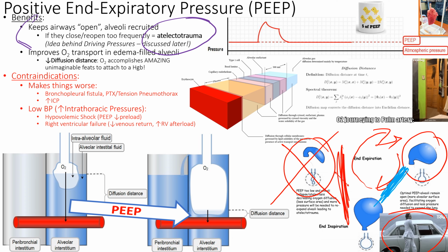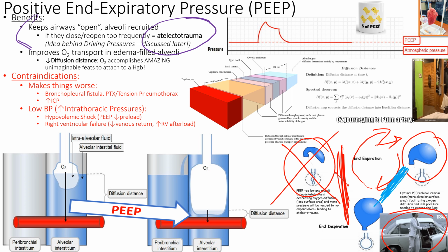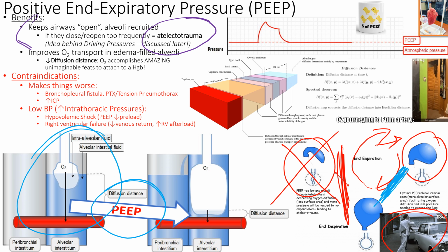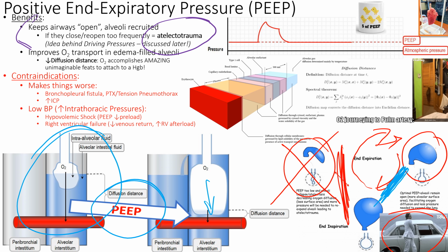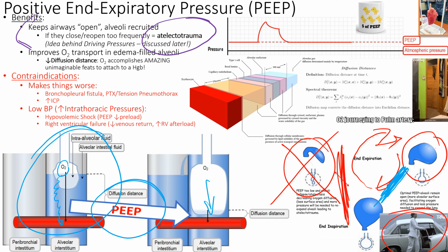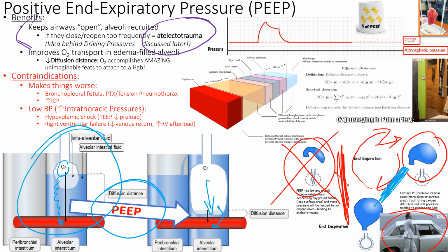Like we said in the previous slide, when it comes to pulmonary edema and CHF, we're going to throw them on 10 of PEEP, right? Because we know that's going to help push all this fluid from this state to this state with PEEP. So it's helping push that fluid aside a little bit, and it's going to help the oxygen, instead of traveling from all this area here, just from here to here, right? It's a lot less distance traveled, right? It's like traveling the One Ring to Mordor, right? So it's better if it's just from the Shire over to the first inn right there, right? Done, right? Whereas before, if you're going to Mordor, it actually took 17 years in the book for him to go from one place to the other. So we want to improve that time.